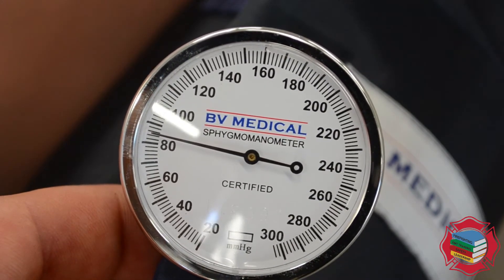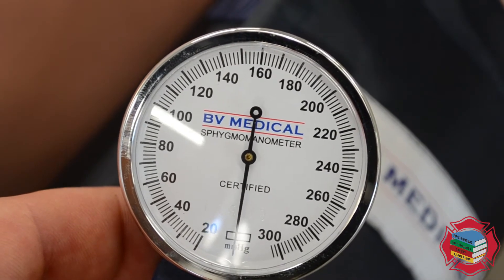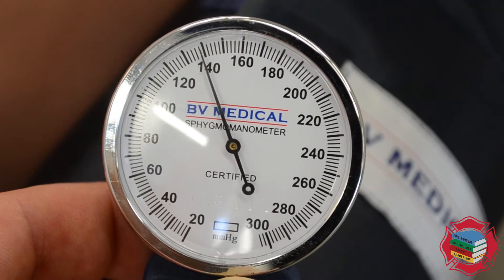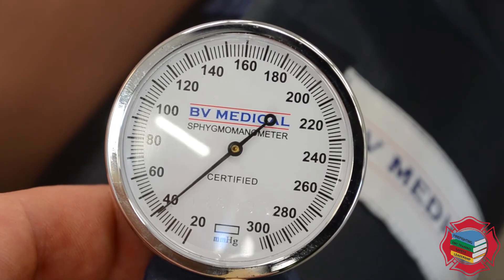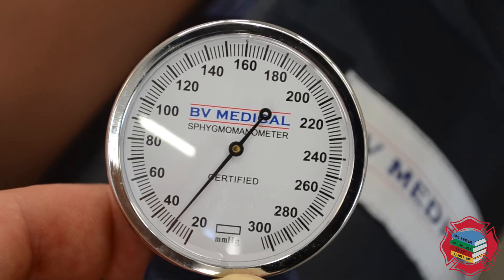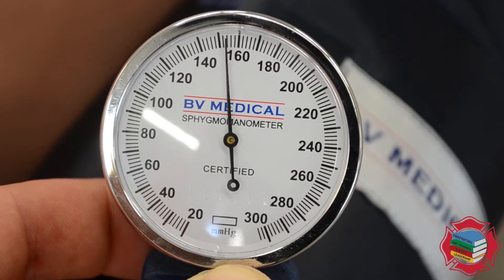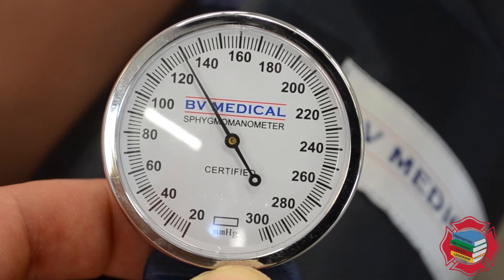If you rapidly dump the air out of the bladder you tend to skip large portions of the blood pressure and end up with glaring inaccuracies in your vital signs, which is something we want to avoid at all times. So again, when you inflate the cuff — 160 is just an arbitrary number that you will modify depending on your patient population — this slow rate is how the needle should be falling.